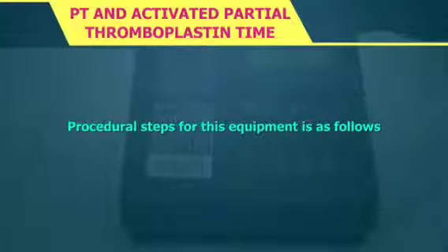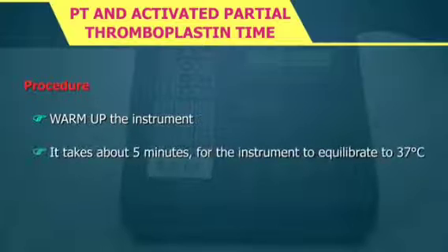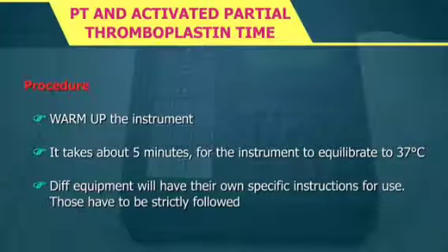Procedural steps for this equipment are as follows. Warm up the instrument. It takes about 5 minutes for the instrument to equilibrate to 37 degrees Celsius. Different equipment will have their own specific instructions for use. Those have to be strictly followed.